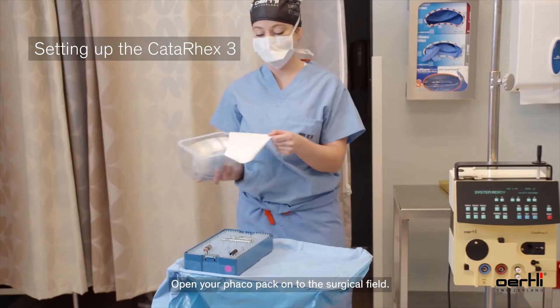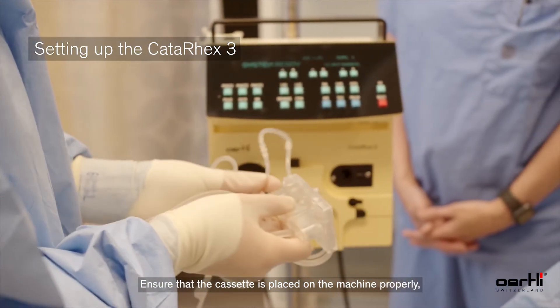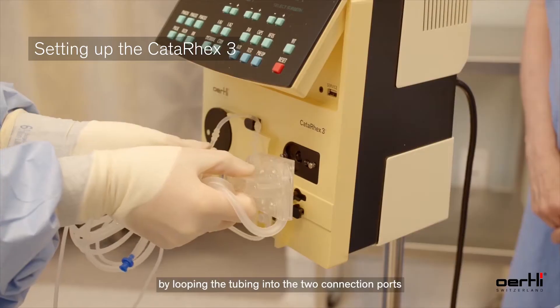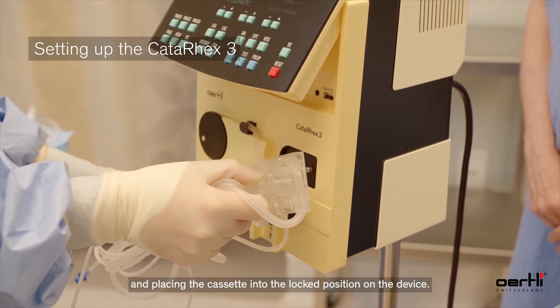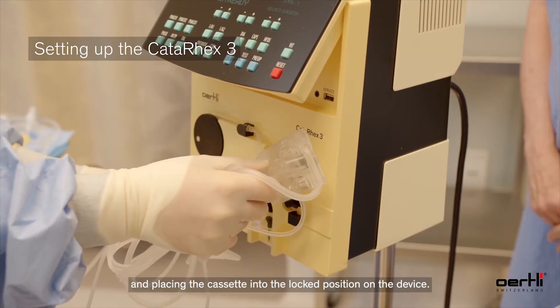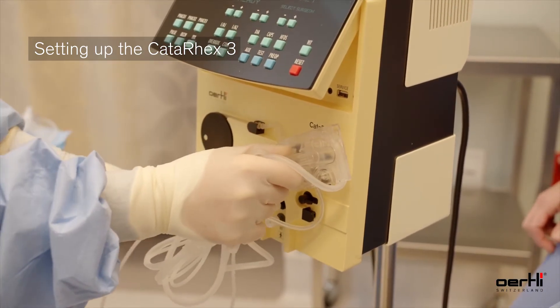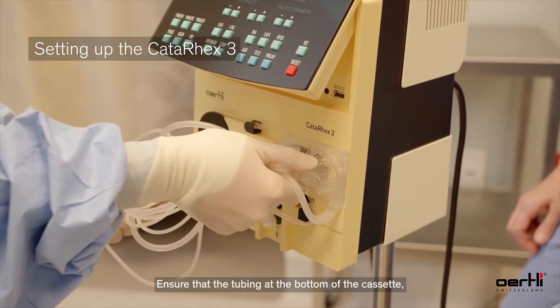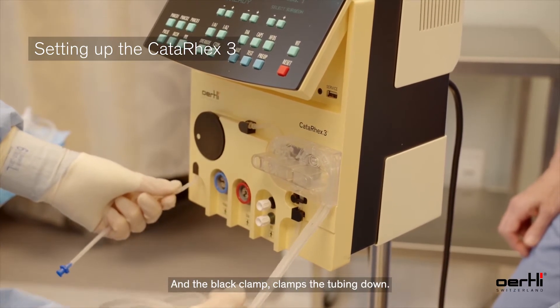Open your FACO pack onto the surgical field. Ensure that the cassette is placed on the machine properly by looping the tubing into the two connection ports and placing the cassette into the lock position on the device. Ensure that the tubing at the bottom of the cassette is pulled and locked into place and the black clamp clamps the tubing down.